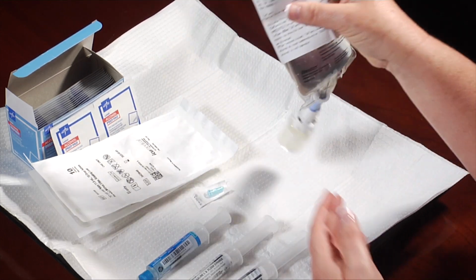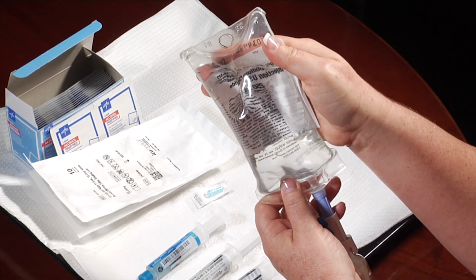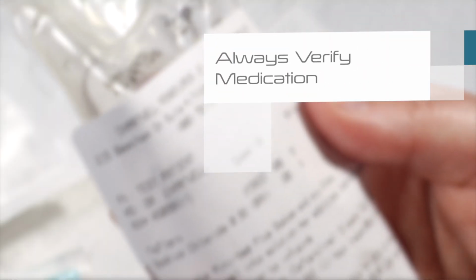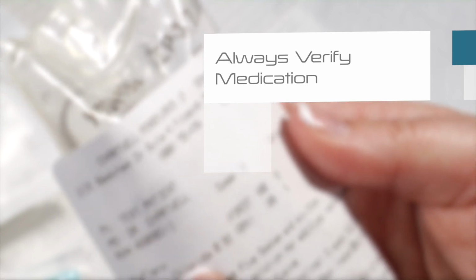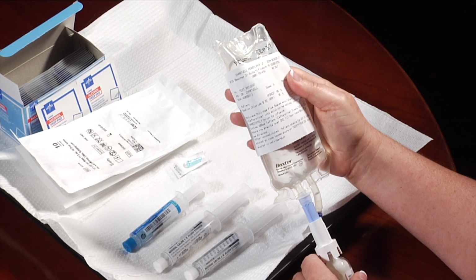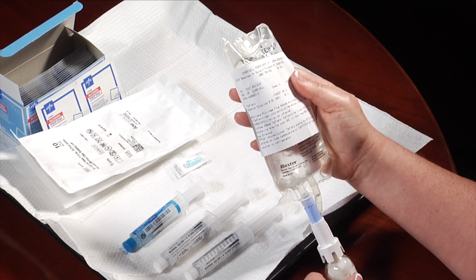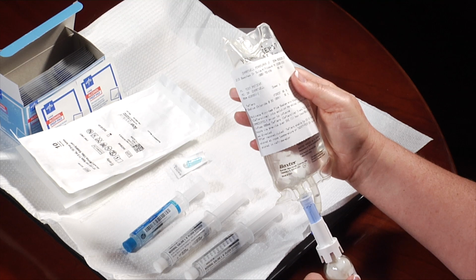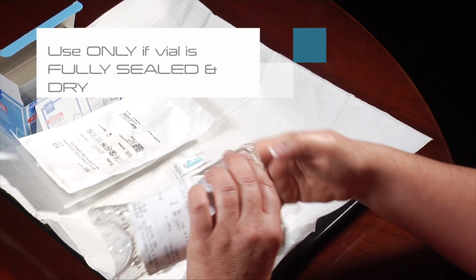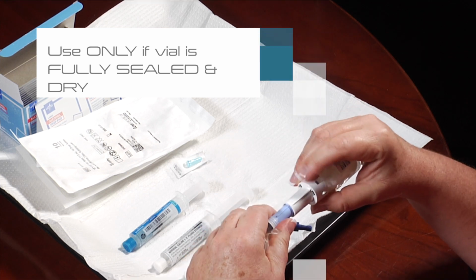Inspect the bag of medication for any leaks, particulate matter, and clarity of medication. Check the label on the medication bag for the correct patient name, drug, and frequency. Prepare the bag of Vial Mate medication as directed by your home health care nurse. Squeeze the bag and check the vial for any system leaks.